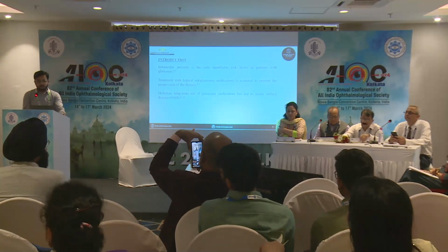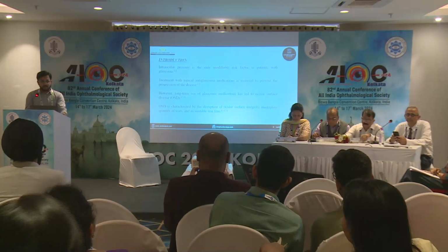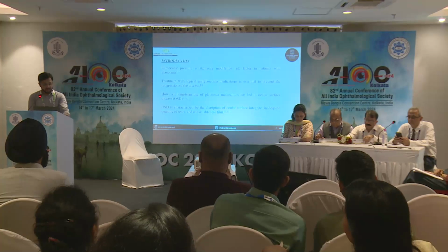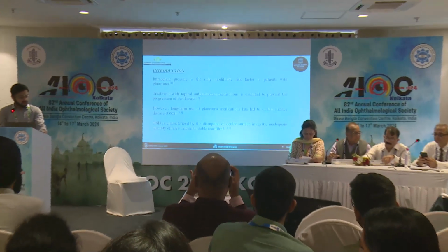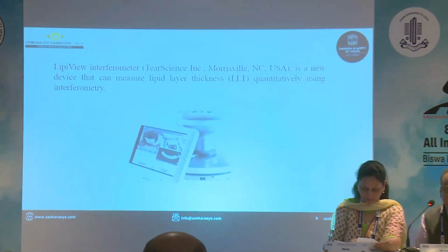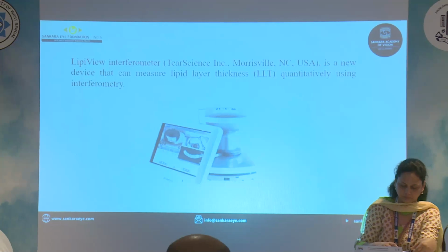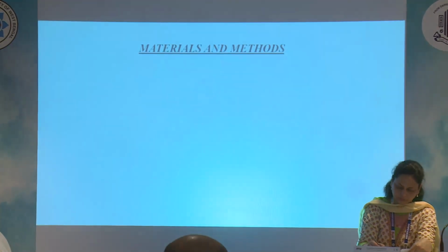However, the long-term use of glaucoma medications has led to ocular surface disease, which is characterized by disruption of the ocular surface integrity, inadequate quantity of tears, and an unstable tear film. The LipiView interferometer developed by Tear Science is a new device that can measure lipid layer thickness quantitatively using interferometry.